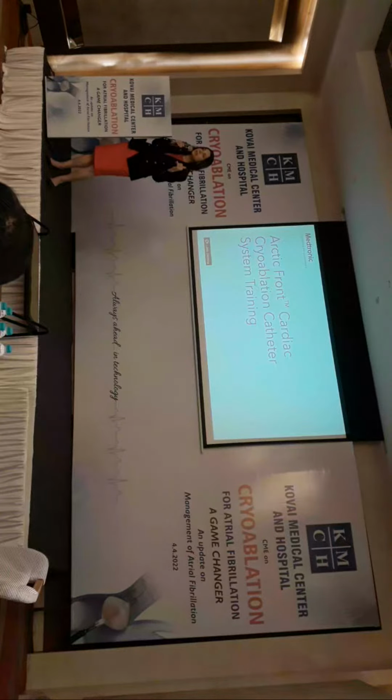I'm going to be able to get in, cross over, and eliminate all PV potentials. And not everybody just has 4 veins. I've seen over the years patients with 5 veins, 3 veins. We had a left common pulmonary vein today. I've had patients with a right and left common pulmonary vein simultaneously. But I always tell them eliminating those triggers, that's the easiest part of their treatment. They'll go home later that day, they'll feel great.